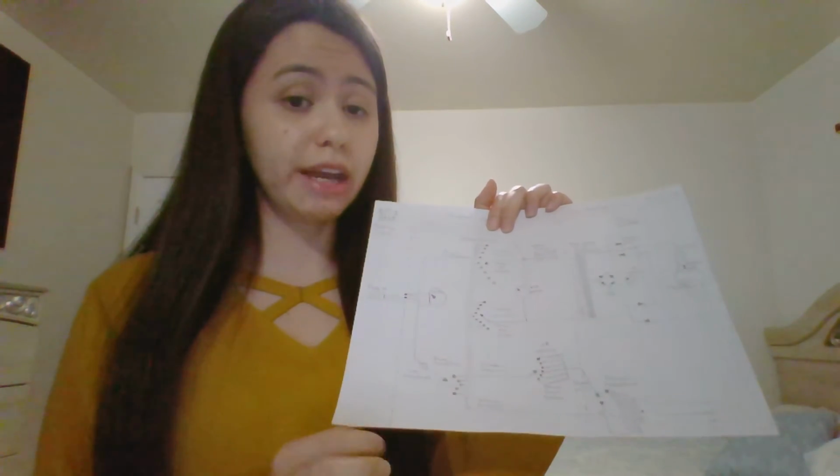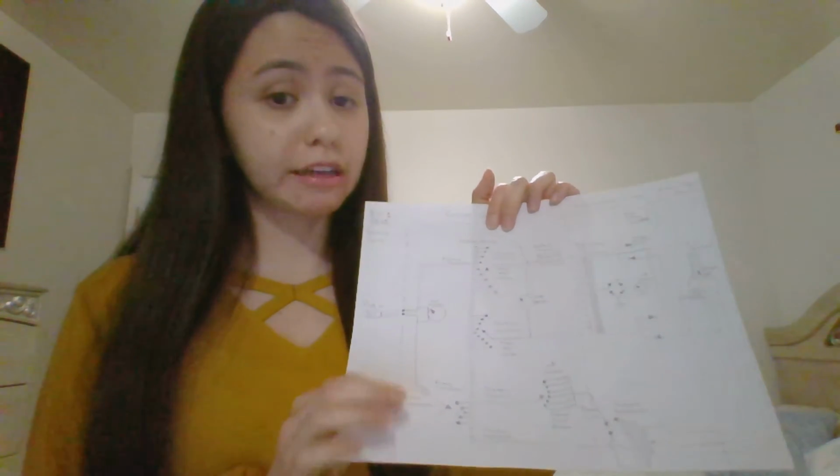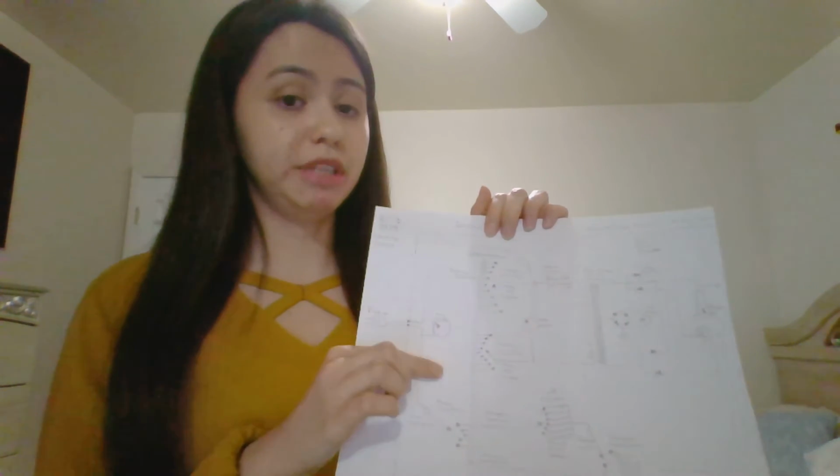And there's also a line compensator, and that also reads the voltage and compensates for any fluctuations that there may be in the voltage. So all it's doing is maintaining a constant voltage. So if we go back up here, the voltage that's coming in is going to go through an auto transformer. And the auto transformer is either going to step up or step down the voltage.